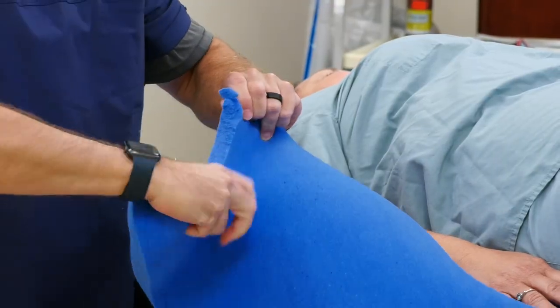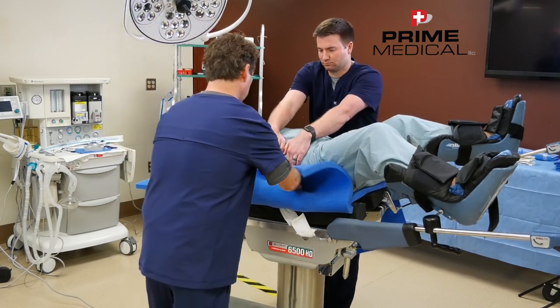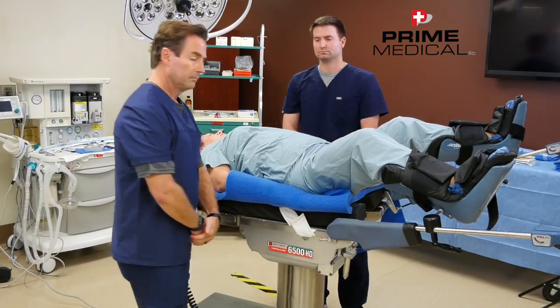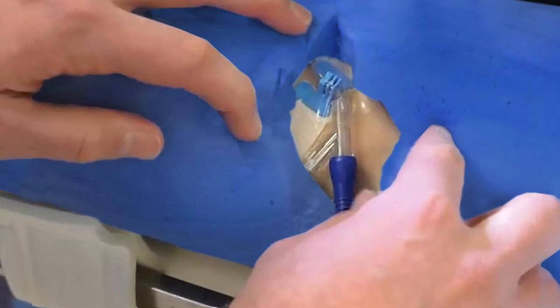Log roll the patient from the opposite side to secure the foam underneath the patient's torso, which will hold the arm tucking and protection wings in place. If anesthesia needs access to the IV or pulse oximetry site, simply tear a window over the foam.